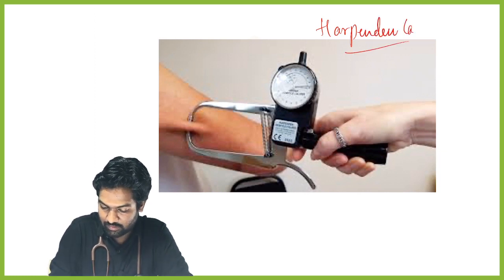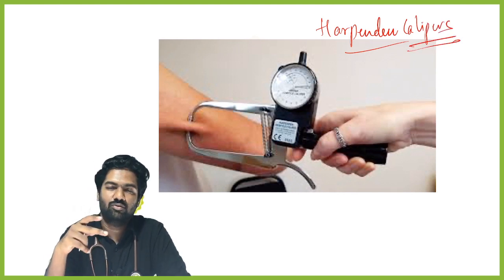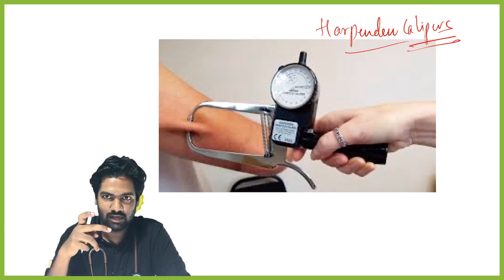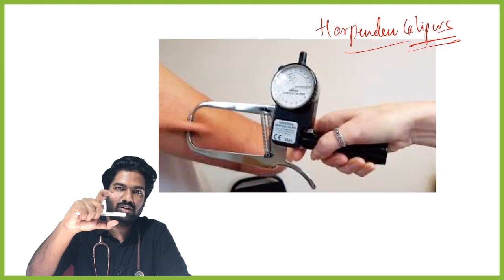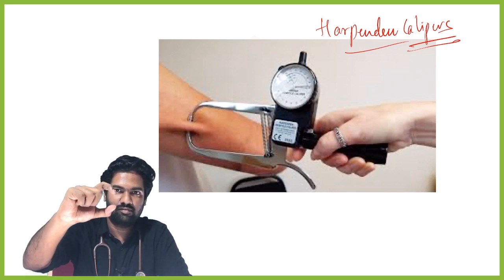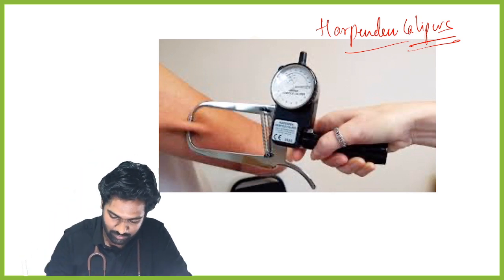Okay. Calipers. Wherever they are used, even in physics or engineering, if you are using calipers, you are trying to measure the thickness. Once the distance between these is identified, this is calipers. Now here you can see that they are using it on the skin.